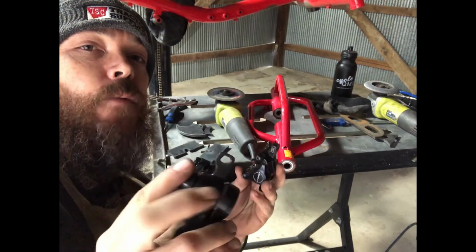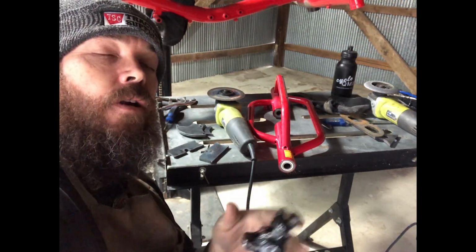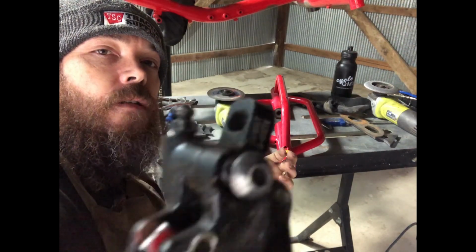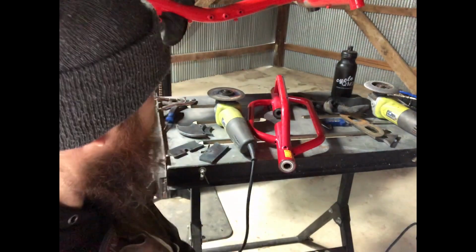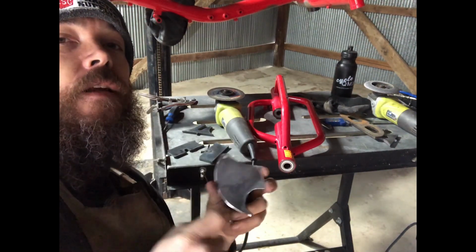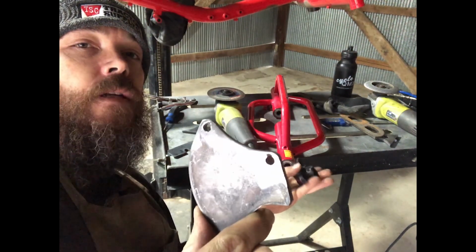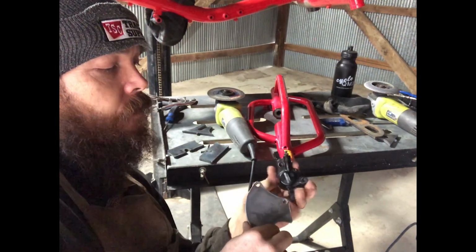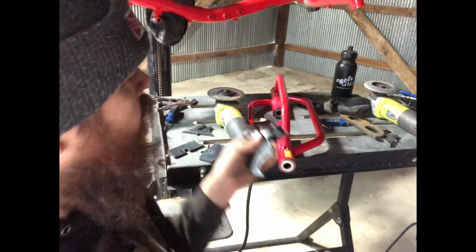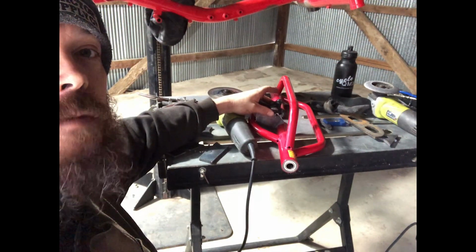Alright, now that we got that all cut up, whether you choose mechanical disc brakes or you go with the Tektro hydraulic disc brakes, either one, we're going to want to put disc brakes on this. So with our disc brake mount, I guess I could have cut a little more material out here, just a little weight saving. Maybe on future models I'll have that, but for this one, this is what we get, big chunk of steel. And how this is going to work is our brake caliper is going to go right on there with the little mount, and this whole assembly is going to go right inside here, just like such. And now we'll have a disc brake mount.